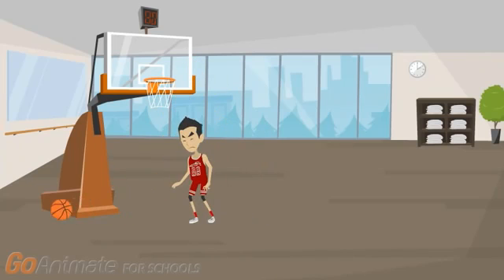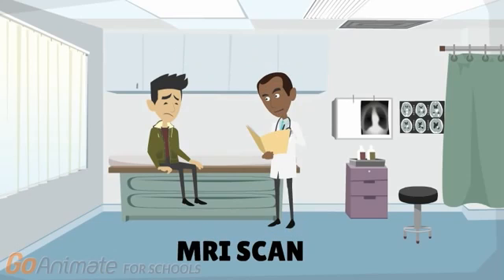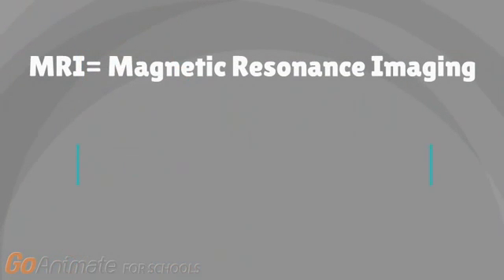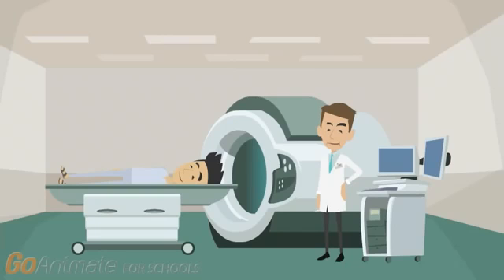This is Michael. Michael suffered a knee injury while playing basketball last week. After an appointment with his doctor, Michael finds out he'll be needing an MRI scan to determine if he needs surgery. Well, what exactly is an MRI? An MRI, which stands for Magnetic Resonance Imaging, is a technique used to generate an image of one's body non-invasively.